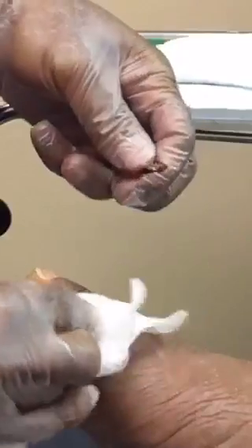This sharp surgical debridement has been very successful here.